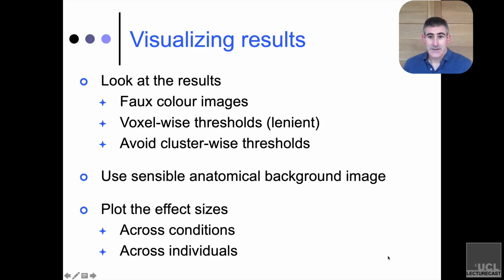One of the things that I always emphasize is choosing a sensible background image. And I think this is something that doesn't get a whole lot of thought. I think that people just pick whatever's convenient, and often they default to using canonical images that are very precise and look great, but maybe start to give you the incorrect information because it's not an appropriate choice. So I think it's important to at least consider what's the right background image to use, and then you can decide as appropriate for yourself.